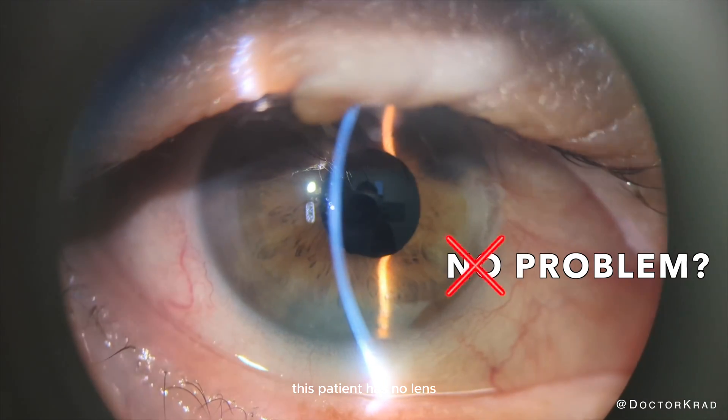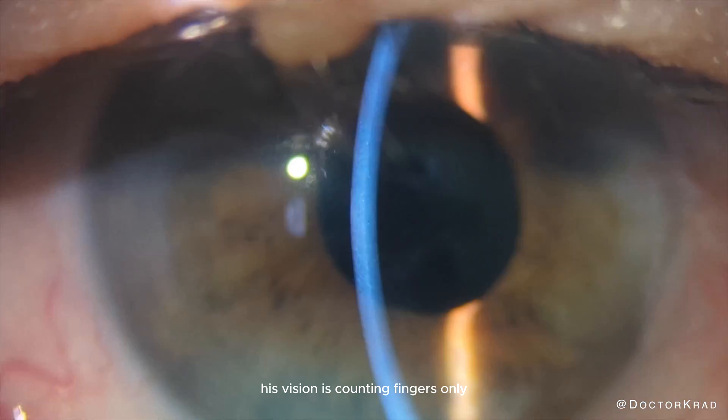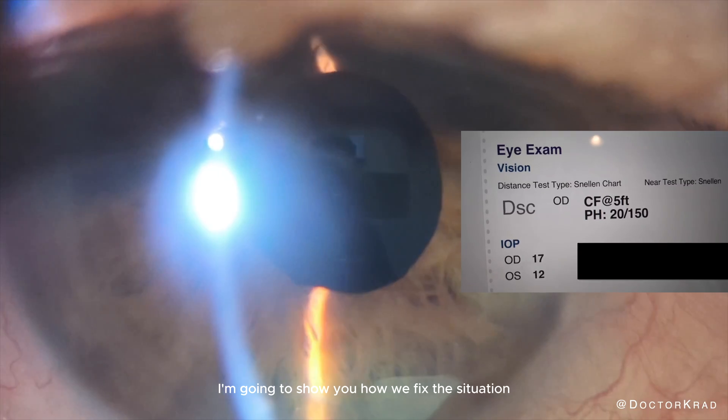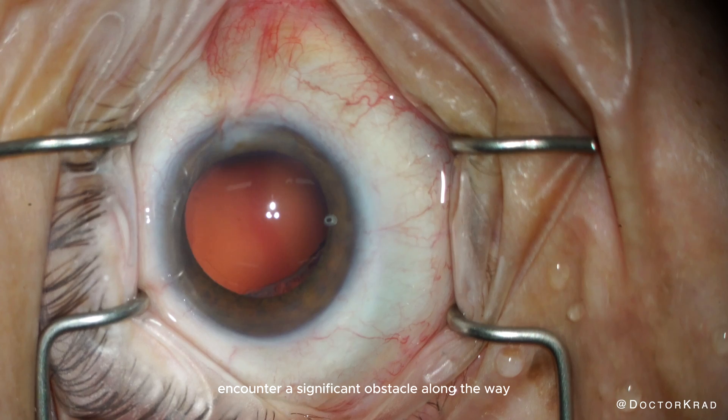As you can see, this patient has no lens, no capsule, or zonules. His vision is counting fingers only. I'm going to show you how we fix this situation, although we do encounter a significant obstacle along the way.